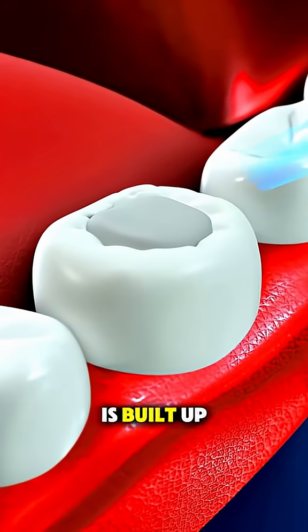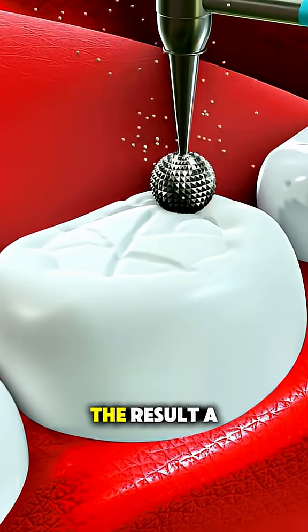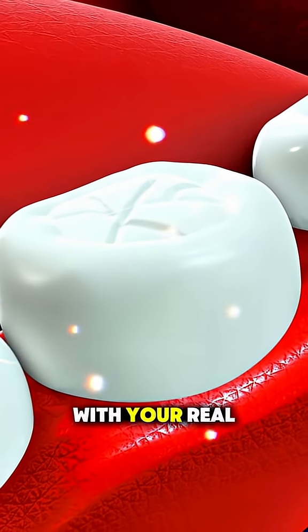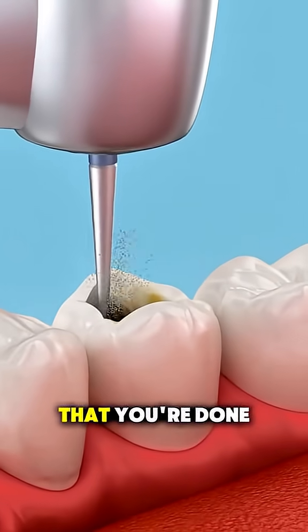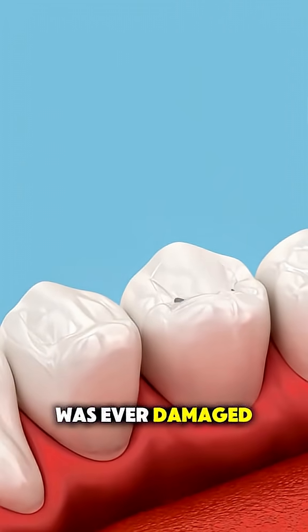Once the filling is built up, they polish and smooth it to make sure it feels natural when you bite down. The result? A strong, invisible fix that blends right in with your real tooth. And just like that, you're done — pain-free, quick, and you'd never know the tooth was ever damaged.